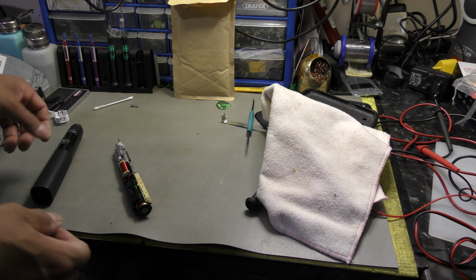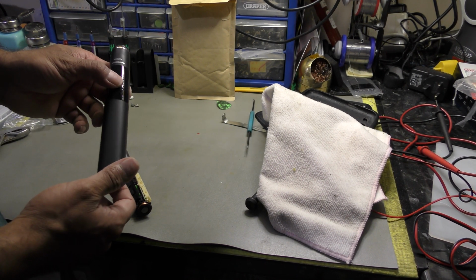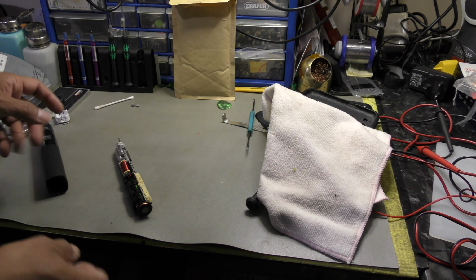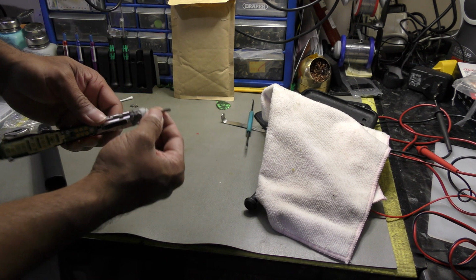A quick video on how I'm fixing my Philips Sonicare toothbrush. This is the HX9351 or 9350. It is a couple of years old, but it's still working fine apart from this bit here.